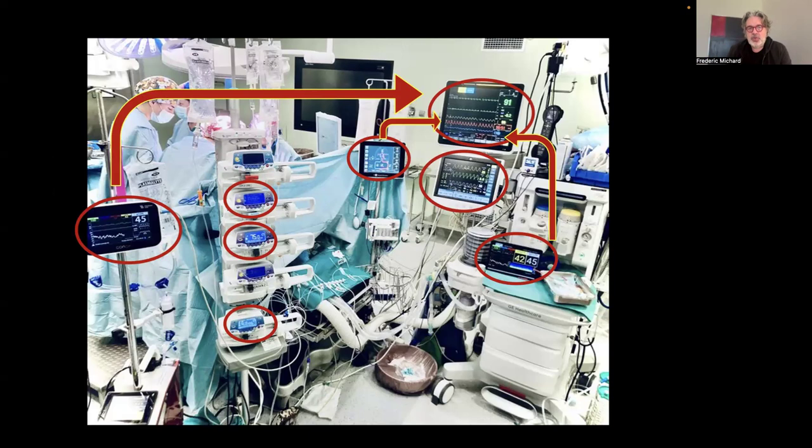Also, it's important to realize that, for example, to monitor cardiac output with a pulse contour algorithm, the algorithm itself is simply software. So it could be integrated into a regular bedside monitor. And hopefully, that's something we will have at the bedside in the near future.